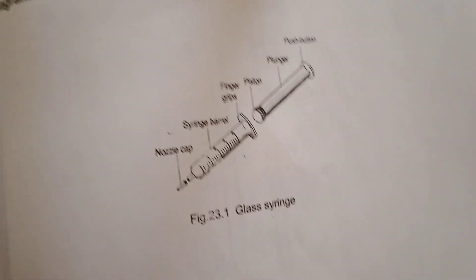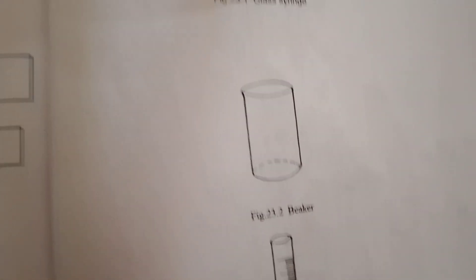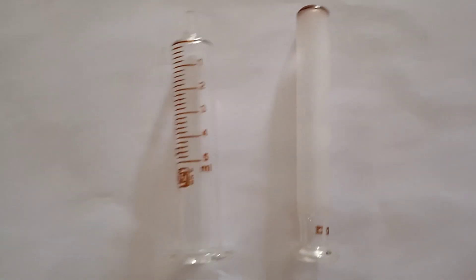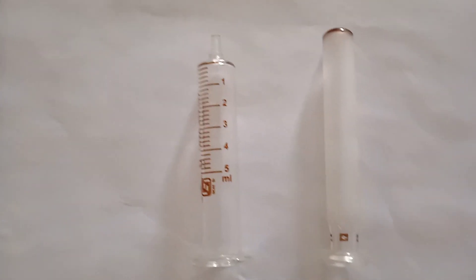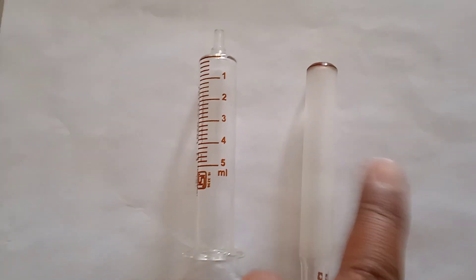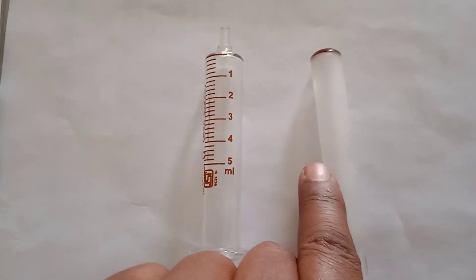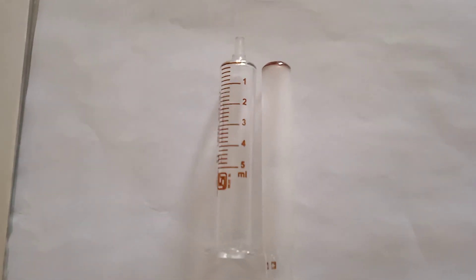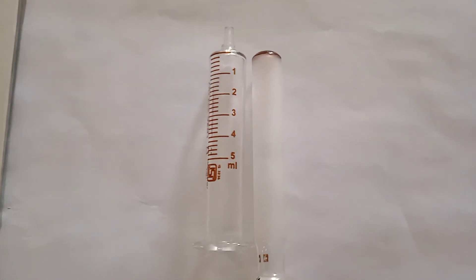Now here some apparatus has been given: syringes, beaker, measuring cylinder, and metal needle. First we will see this syringe — this is a glass syringe. It is having two parts: this is the barrel and this is the plunger. In the market you can find two types of syringes; mainly glass syringes and plastic syringes are used.